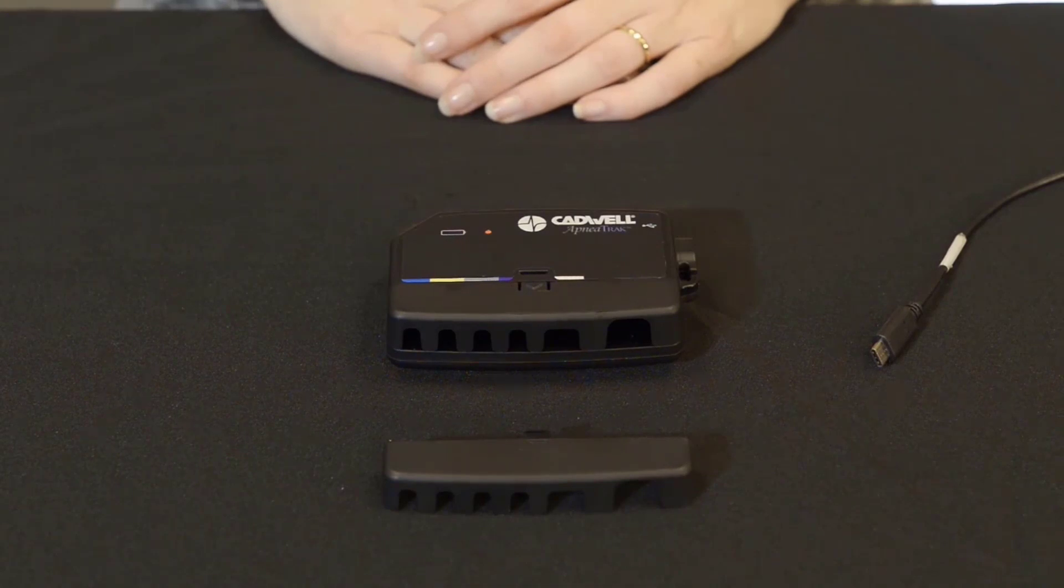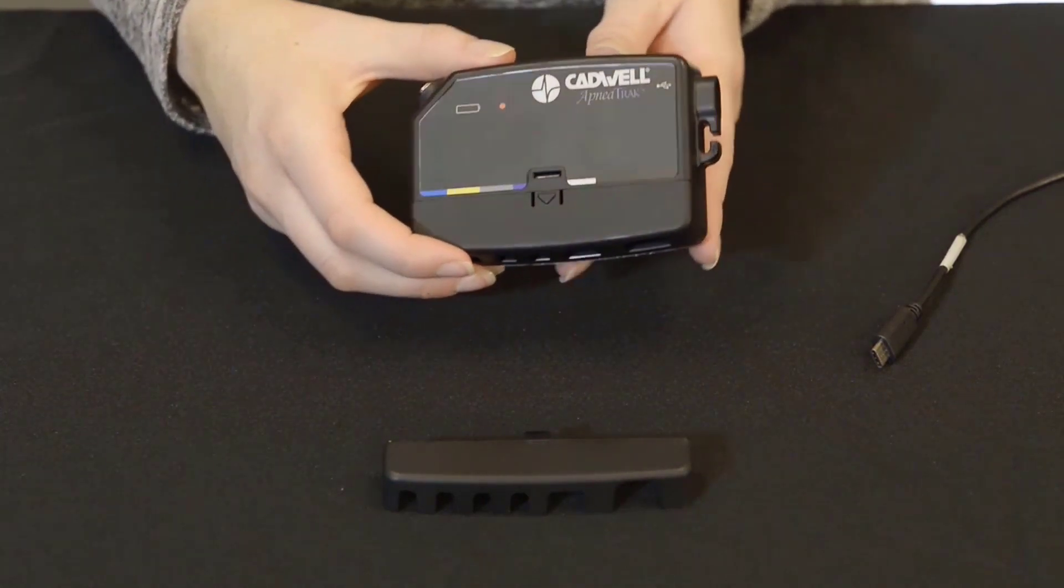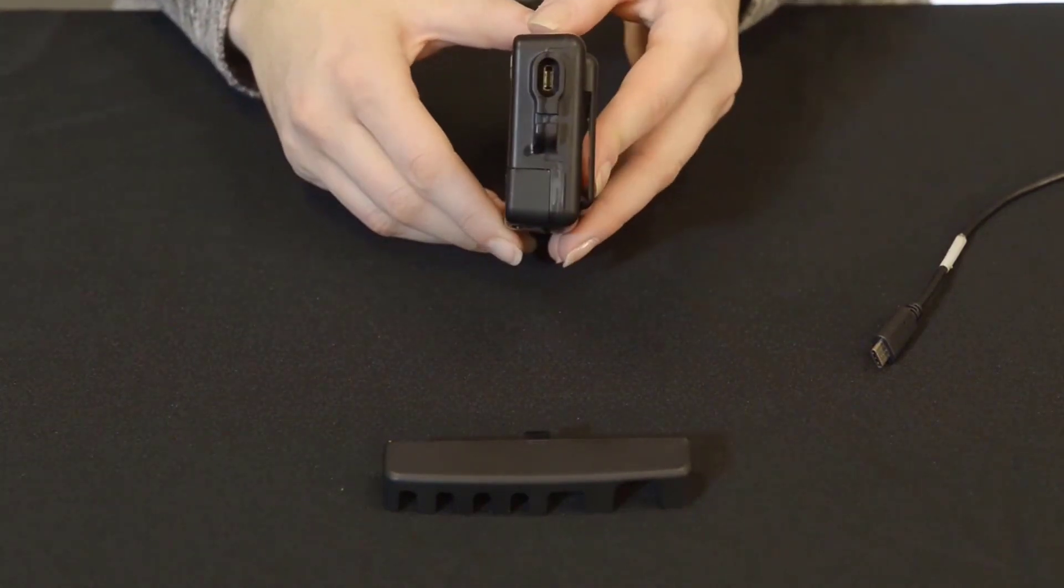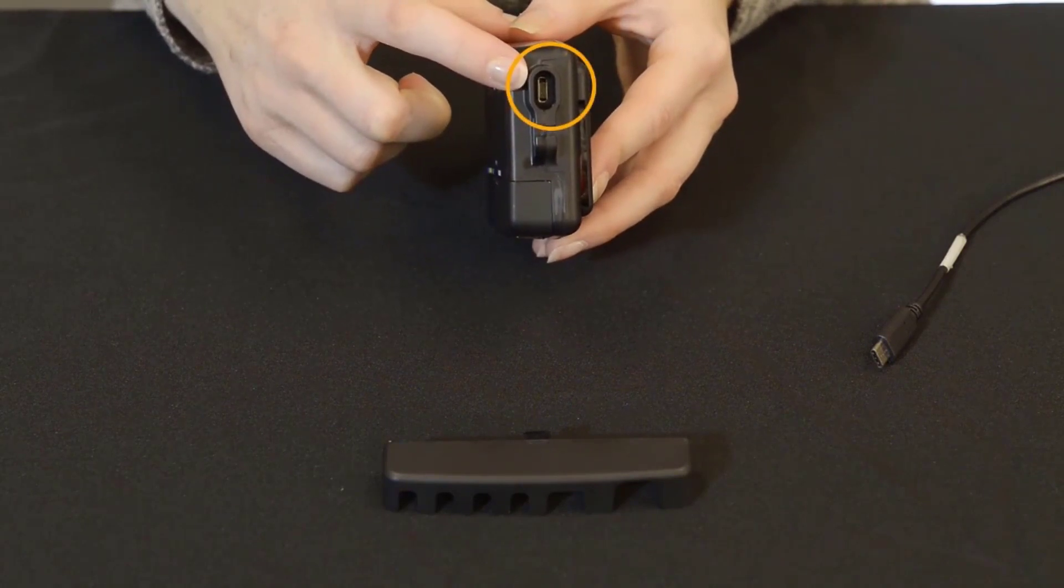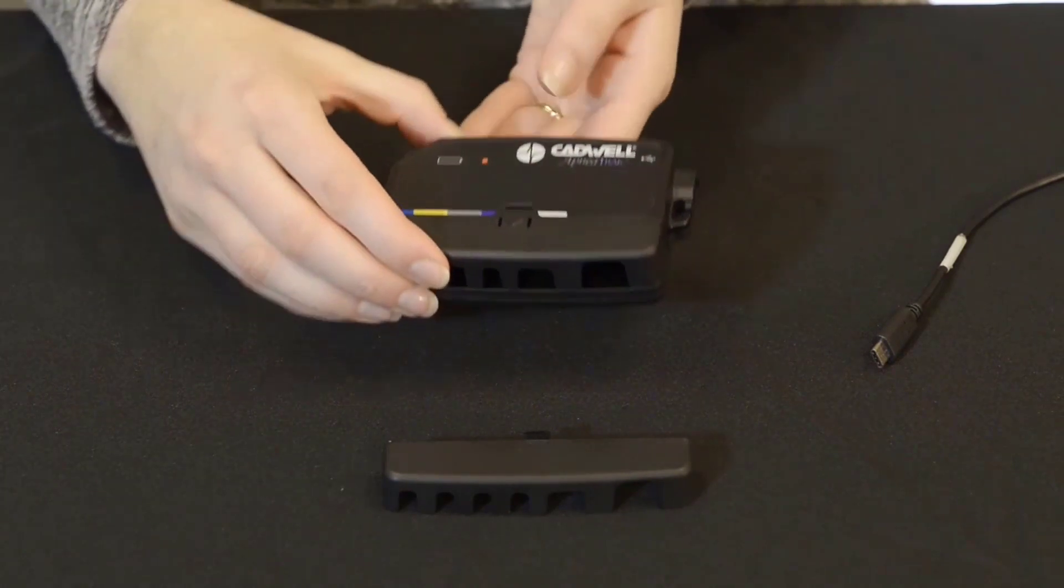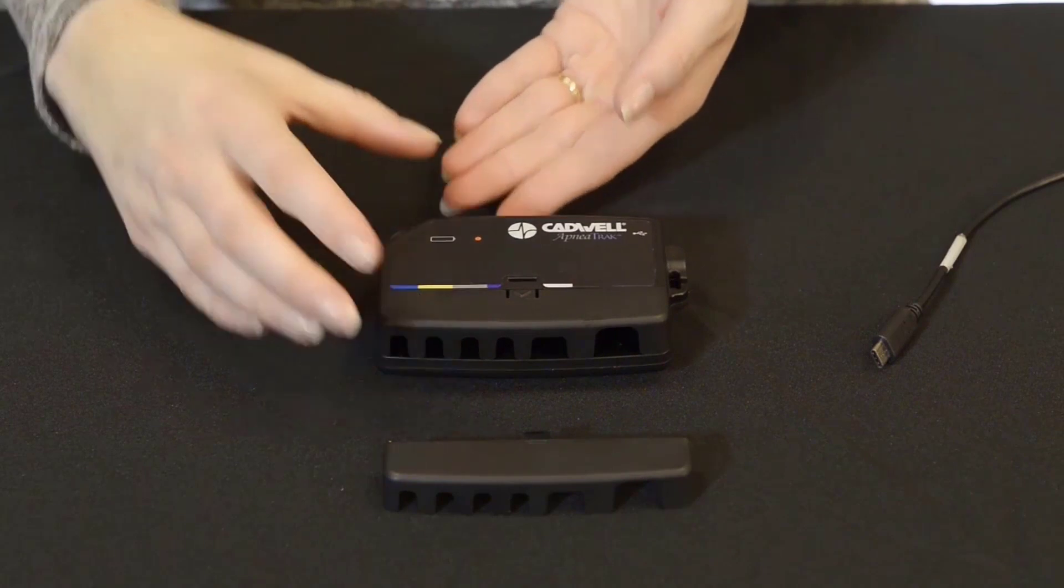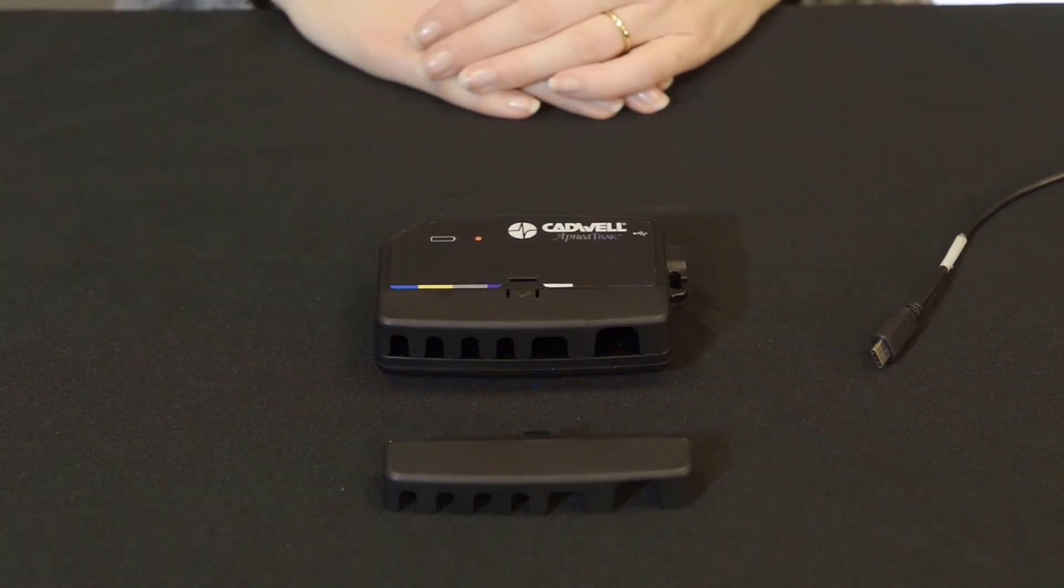Looking at the front of your ApneaTrak, on the right side you will find a USB-C port for charging and downloading data from the device. Before using the device for the first time, we recommend charging the device for 5 hours.